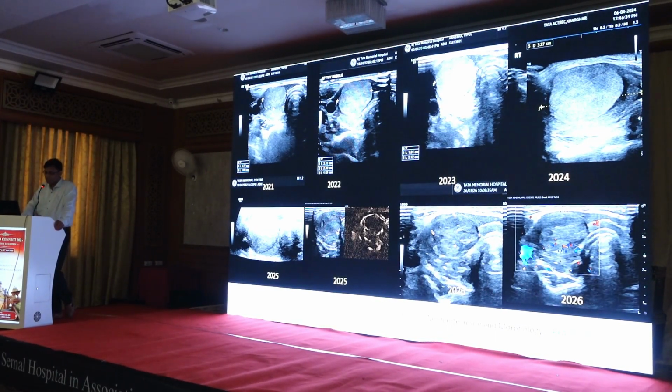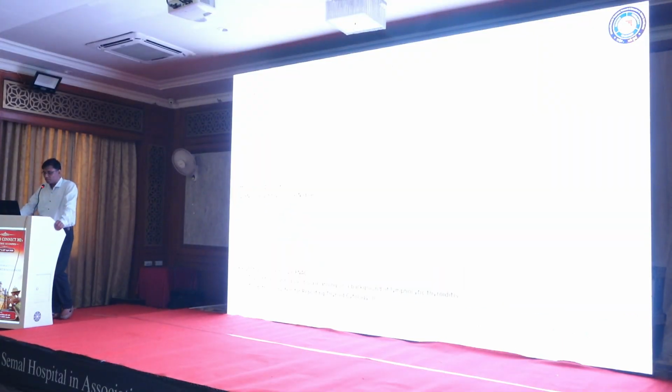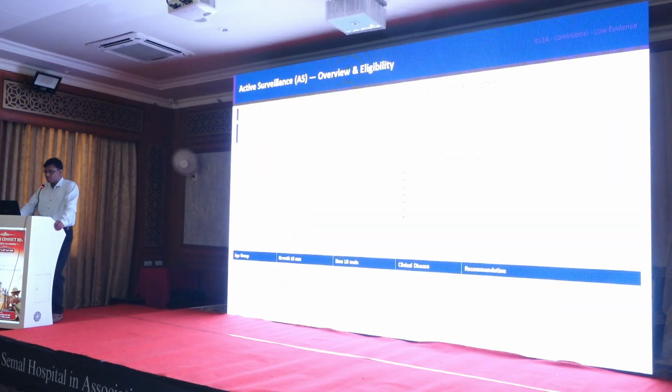And we can see post-ablation, there is no enhancement in the nodule, and actually now it is slowly shrinking in size post-ablation. So this was the pathology of this thing.